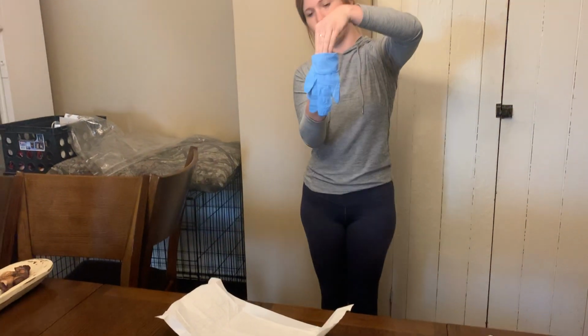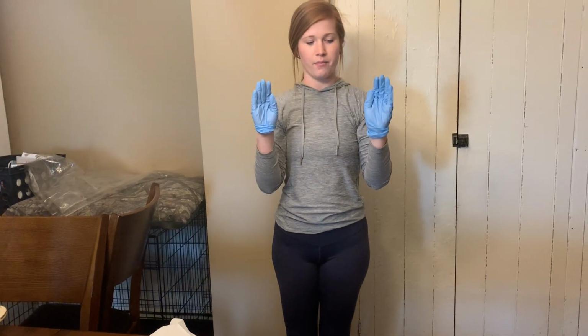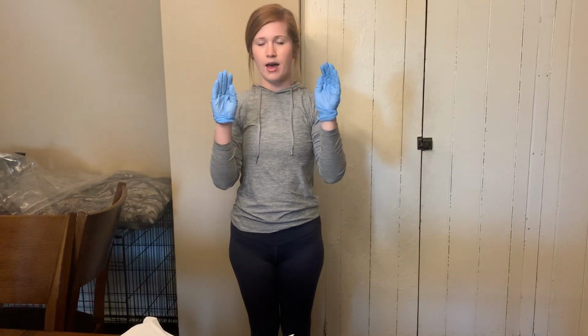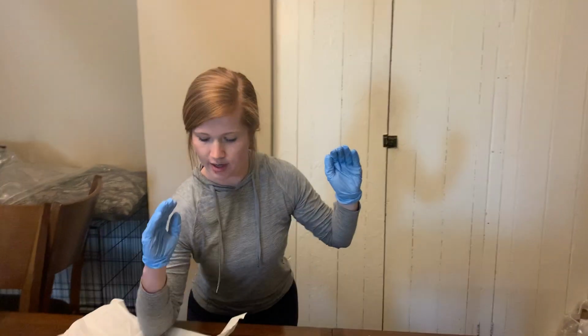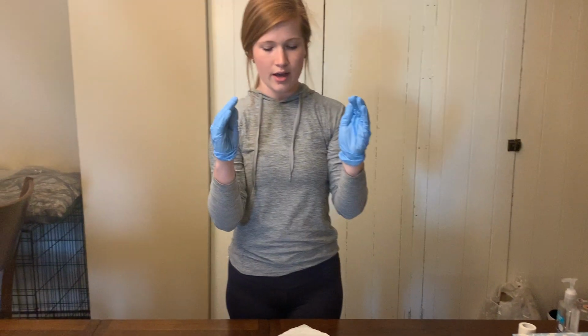Go straight up and back. And glove that dominant, or the other hand as well. So now that I have my gloves on, I'm going to step over here. I'm just going to kind of move that onto the floor. And I'm going to keep my hands above my waist at all times.